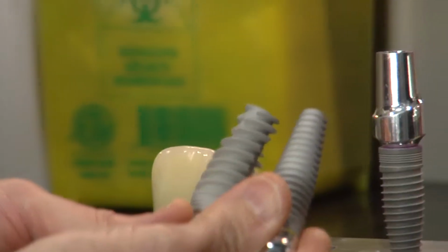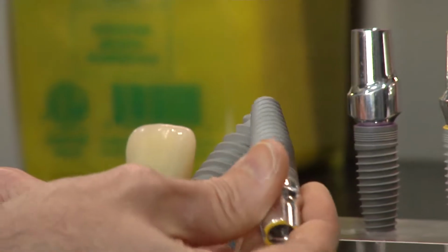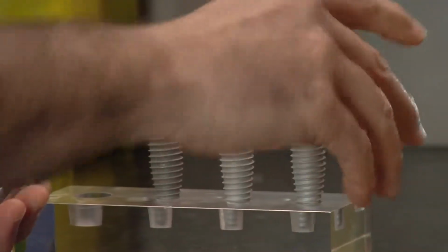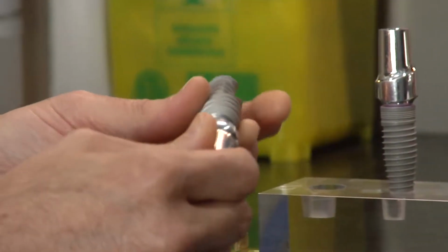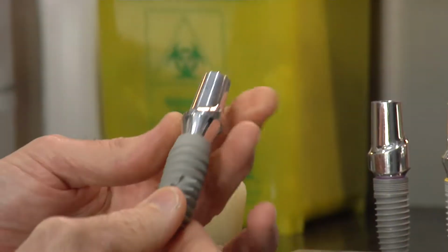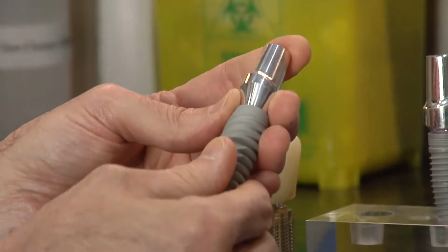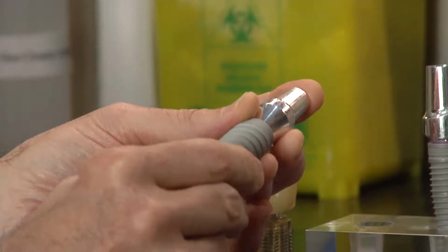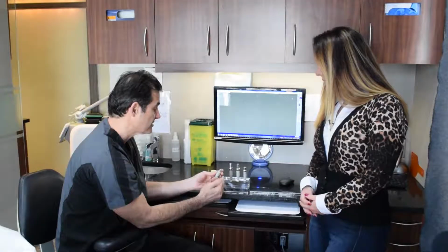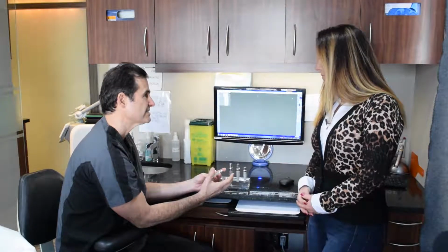Would that be for like a back tooth? It varies. All the implant manufacturers have different thread designs, different thread pitches, and they do things slightly differently. Each company has their own designs and what they think is going to work best. In my practice, I work with about 4 different implant manufacturers. Over the years, I've done thousands of these, and so I select the implant that I think is going to work best in that situation.